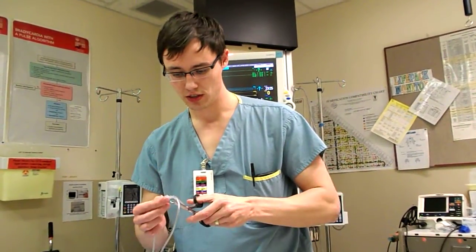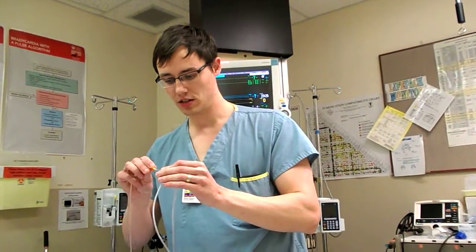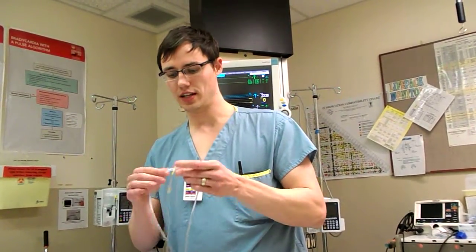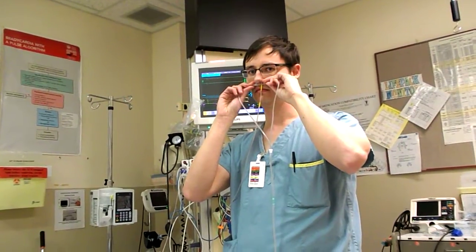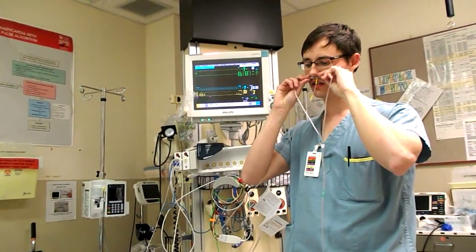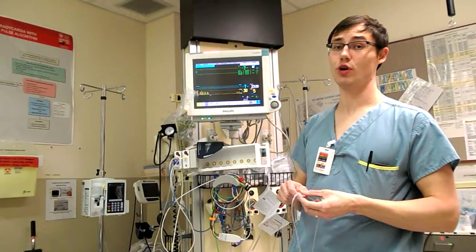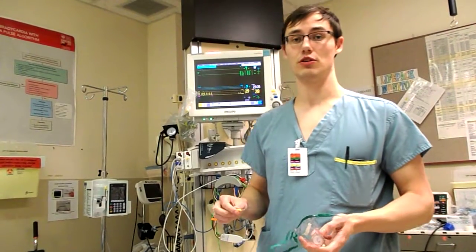You have the end tidal CO2 detector — and you might think this has a lot of dead space, but it still actually works really well. I'm going to show you how you can do it with a set of nasal prongs, or nasal cannula. All you have to do is cut a little hole in the back of one of the prongs, right underneath the openings, and then you can put the end tidal CO2 detector right in there. Looking at the monitor, you can see we have a great waveform. It actually works even better this way than with the face mask.